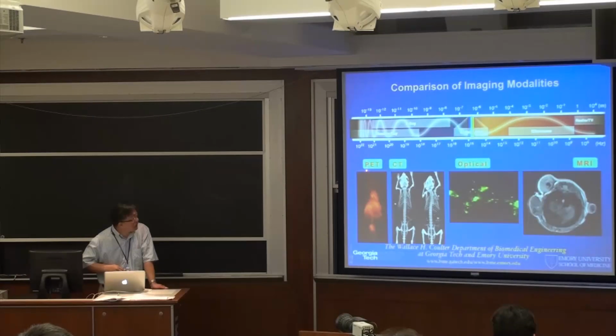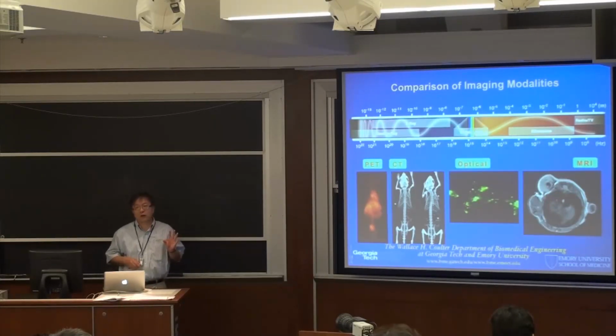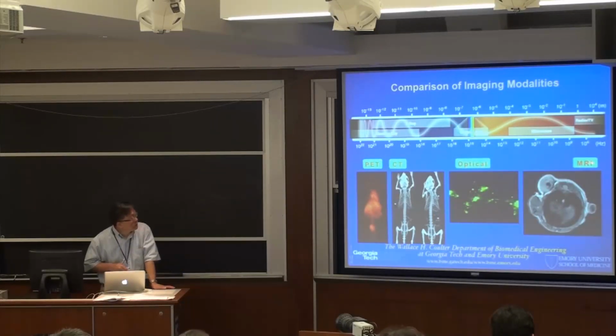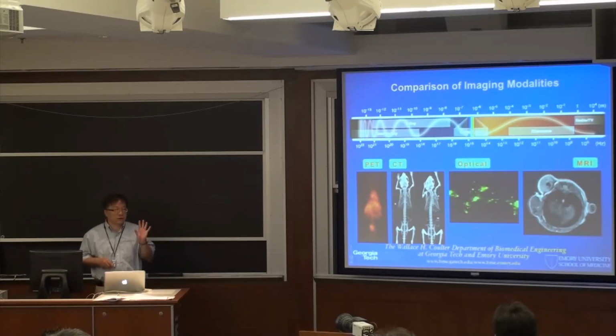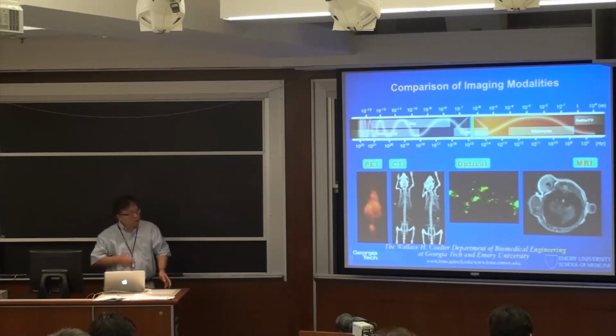So there is also an effort to combine PET with MRI. Okay, so as I mentioned, MRI is mostly for soft tissue. And in that case, it's the same thing. If you have a machine combining MRI and PET, you can use MRI to give you the morphological information, mostly for soft tissue. Then you can use PET to give you the functional information. So this together, of course, will tell us a lot about the state of the soft tissue.